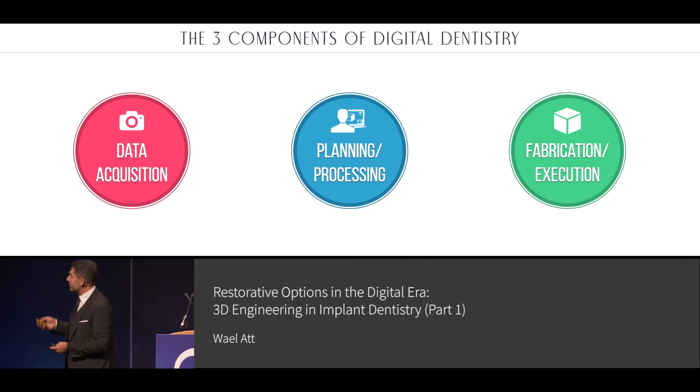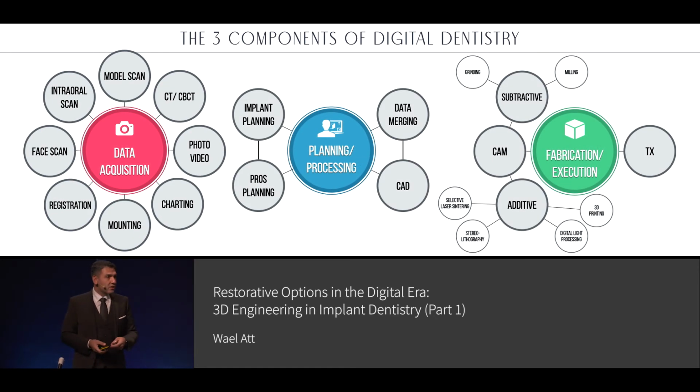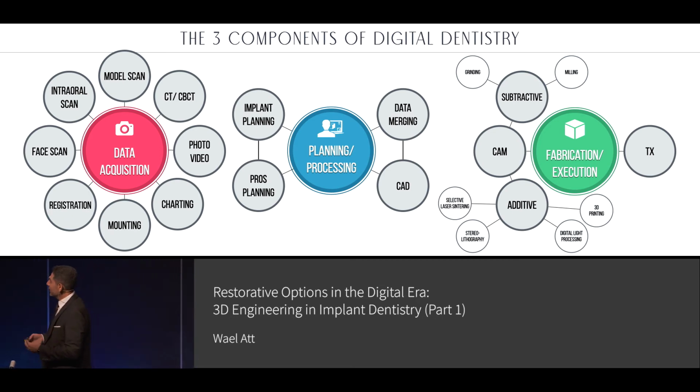So what comes under data acquisition? We have so many different tools. It starts with intraoral scanners. You have model scanners. You have CBCTs, photos, videos, anything that digitizes the data or digitizes the object that you have, or captures the data for you, is under data acquisition.